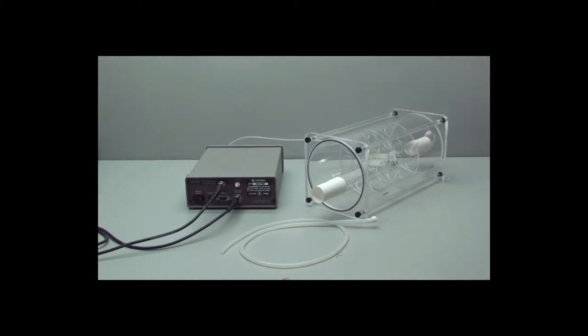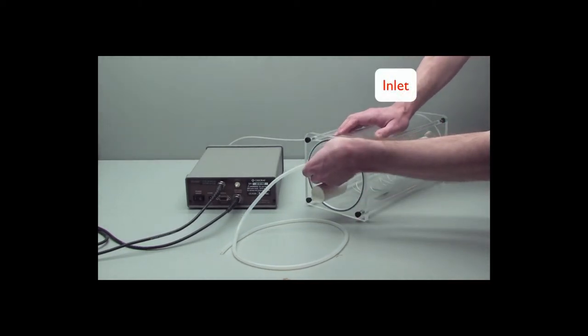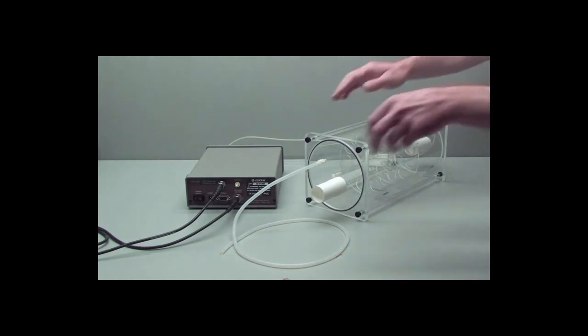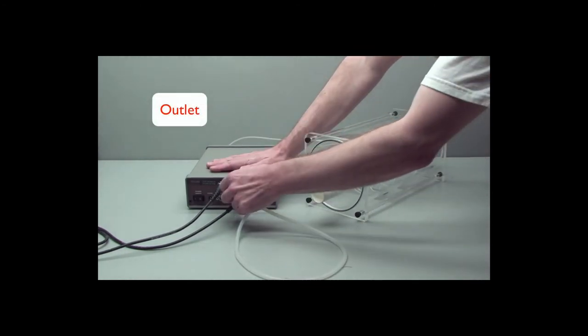Take the other tubing, and that goes to the inlet of the mixing chamber, and the other end goes to the outlet of the gas analyzer.